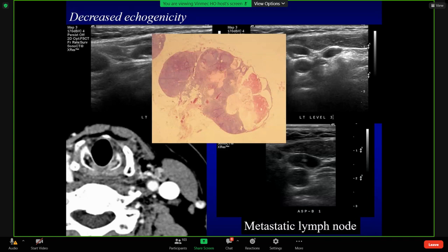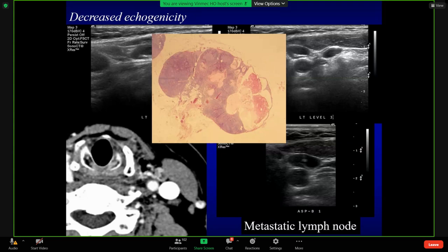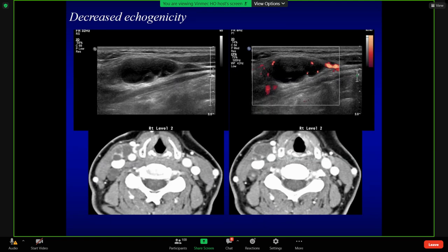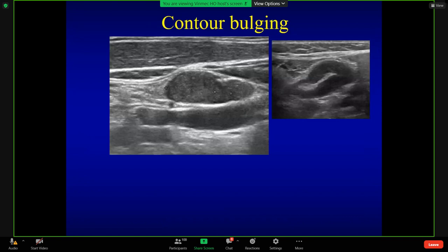The multi-focal low density area represents hemorrhage. Another case shows multi-focal hypoechoic areas like this. CT scan shows multiple non-enhancing areas, which represent internal bleeding. So I introduced increased echogenicity or decreased echogenicity as features of metastasis.